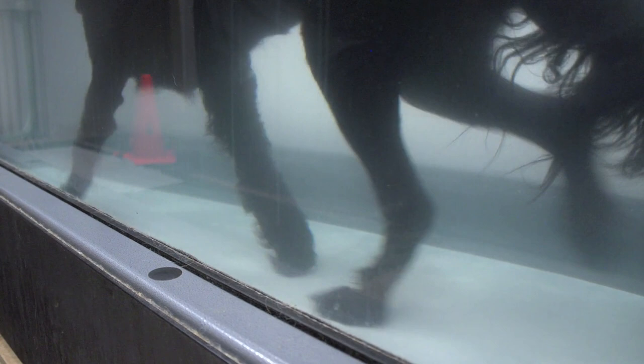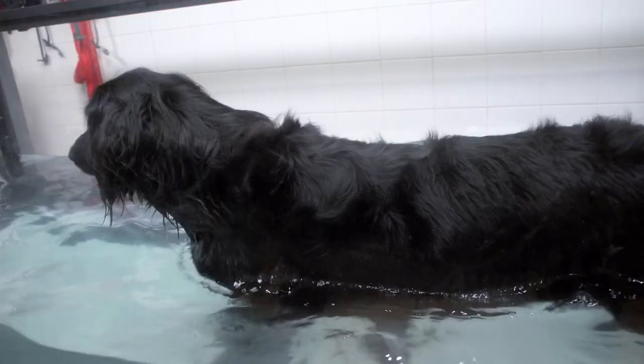So I'm watching for stride length. I'm looking at the back legs. Usually the surgery leg will have a mildly shorter stride, and then as they progress, the stride lengthens. Another thing I'm looking for is how hard they are planting the foot when it comes down. When they're in the water, they tend to weight bear a little bit better than they do on land, so I'm looking for the foot to come down and be planted nice and firmly.